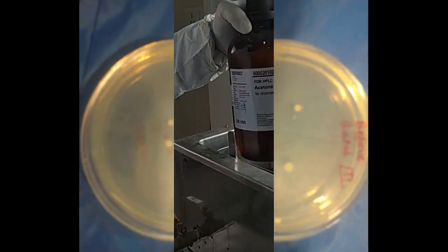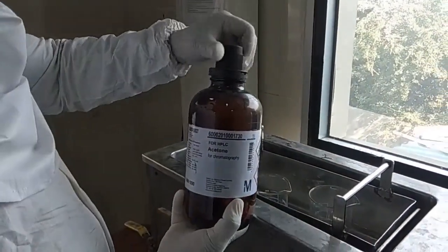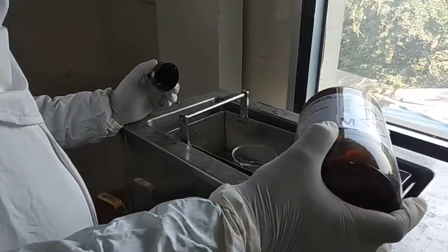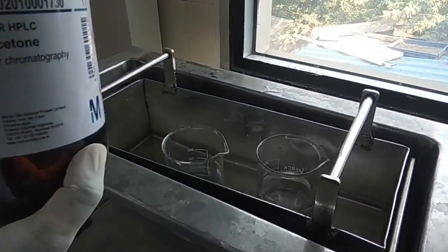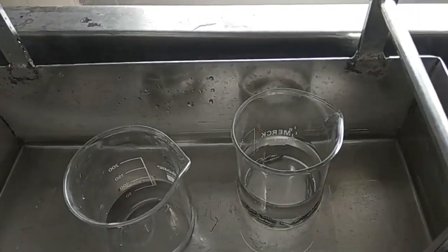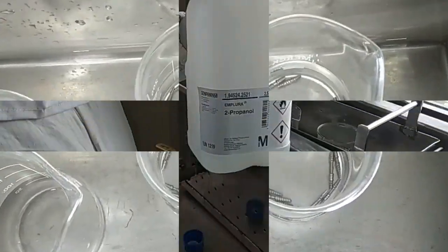This picture shows the bacterial load on the implant after the machining process. After machining, implants transfer to the cleaning and sterilization process, degreasing. Prior to decontamination, the implant must be cleaned to remove particulates, oils and inorganic contaminants introduced during the manufacturing processes. This is done by acetone solvent in 40 kHz frequency ultrasonic cleaners. Ultrasonic cleaners work by subjecting instruments to high frequency, high energy 50 decibel sound waves.